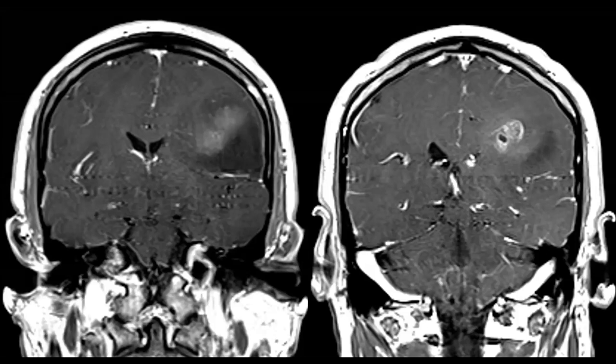I wouldn't call it the classical IDH wild type glioblastoma, because I would expect more necrosis and a more well-defined ring of enhancement. I would say that it might be a grade three or grade four IDH mutant glioma, maybe, but I don't know. Okay, thank you, Octavio.